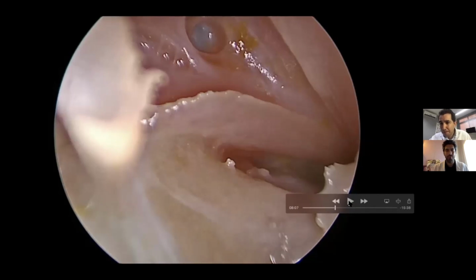Thank you for letting me interrupt you, but it's very important that the participants and everybody understand that what you are using is for anatomical teaching, and people should understand that not always are you able to see such structures if you're not using an angled scope. I'm sorry for interrupting you. Just please go ahead. Yes, you're completely right, and thank you. And if you have other questions, you can interrupt, don't worry.